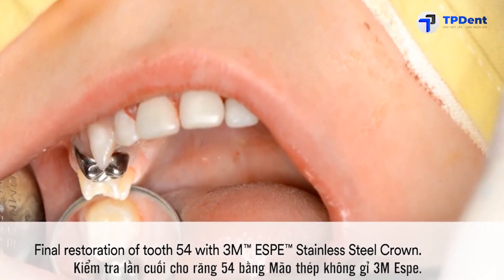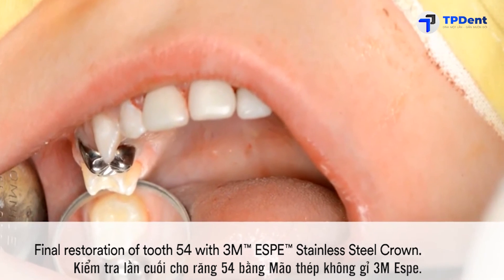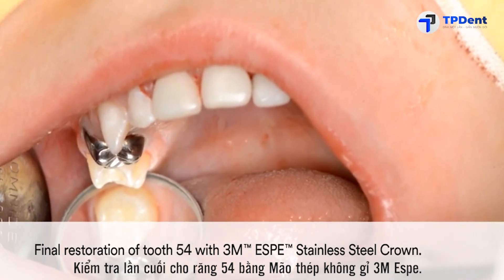The result is a quick and simple yet long-lasting restoration of tooth 54 with the 3M stainless steel crown.